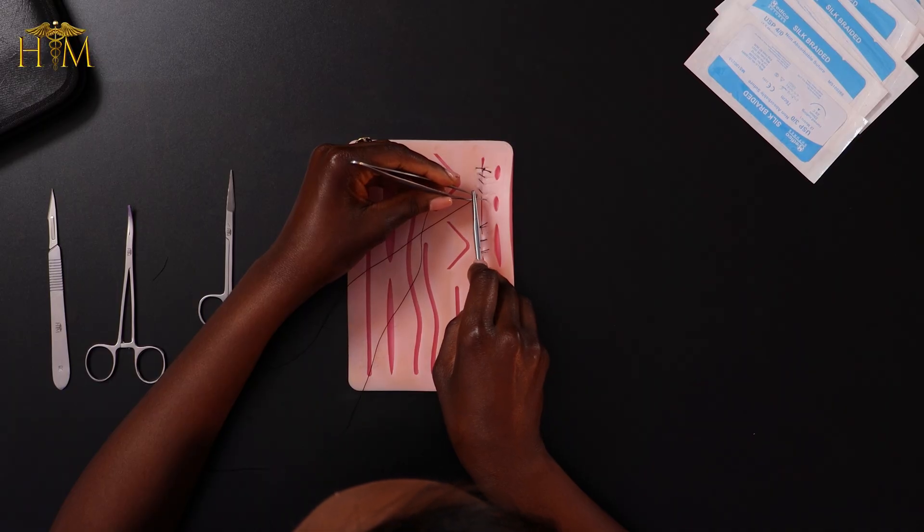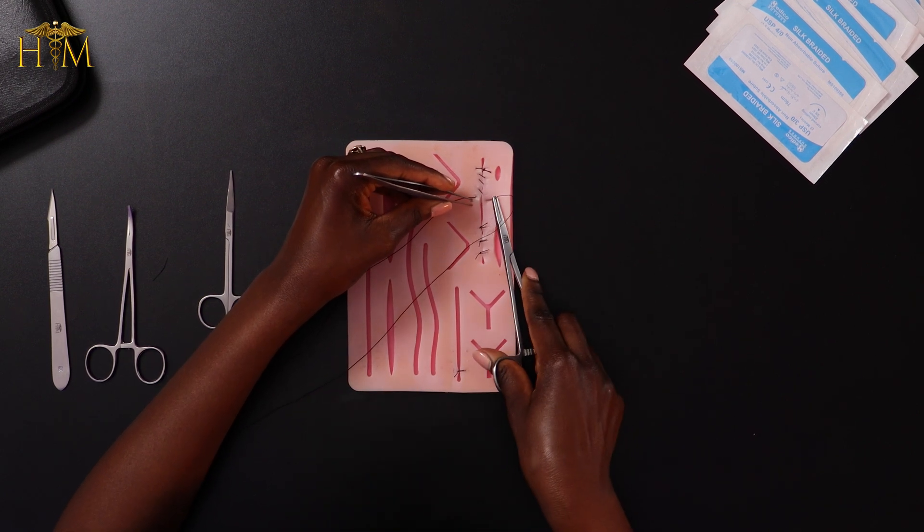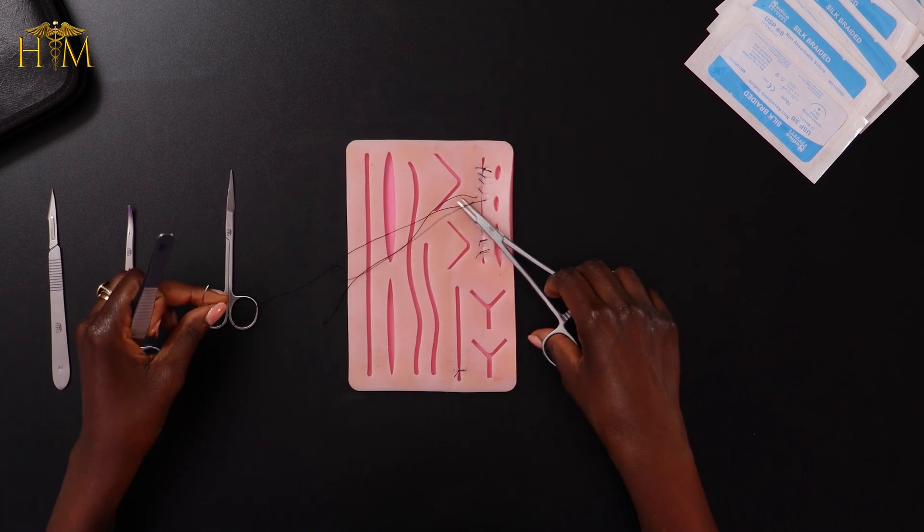You would keep going until you've done the whole thing. Then in order to finish off, you of course have to tie a knot at the end, otherwise it would all unravel. The way that you tie the knot is again quite similar to what you do for the interrupted suture. So positioning my needle on the needle holder, I'm going to go in just like I would for an interrupted suture and come out the other side. Advance the needle, making sure they don't cross over because I don't want any knots. And then what you do now is leave a loop at the end — so instead of just having one suture sticking out, you're going to have a loop. I can put down my forceps now and I'm going to do an instrument tie the same way as I did at the beginning of the running suture and like I do at the end of every interrupted suture, but I'm using the loop to pull through.